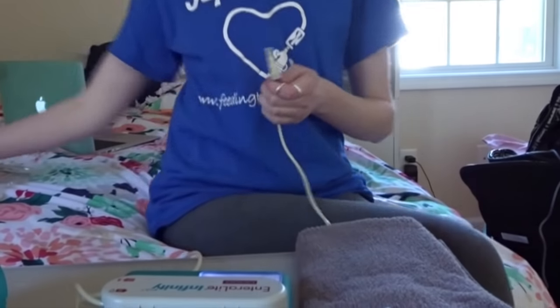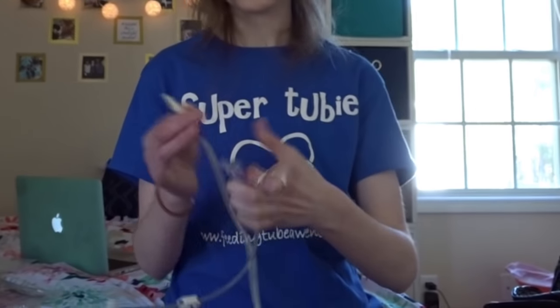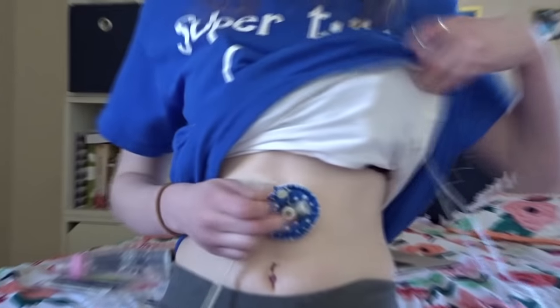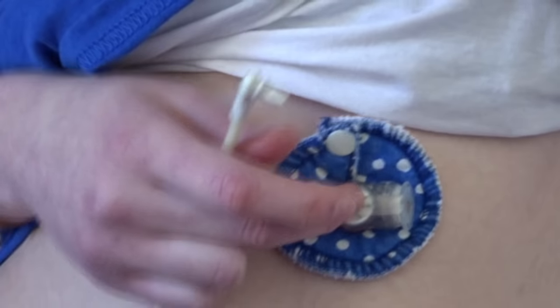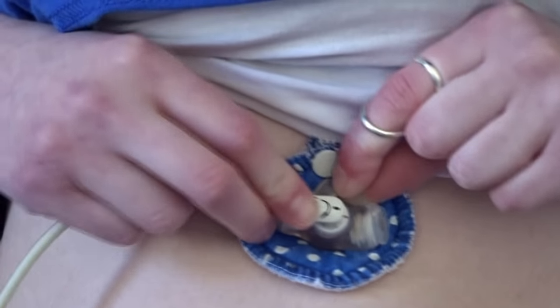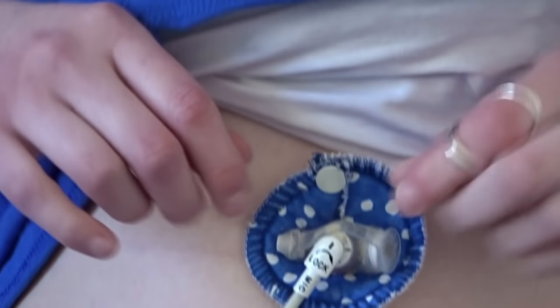Now I'm connecting the end of the bag to the extension. The last step is to connect your extension to your tube and click run. The kind of tube I have is a GJ, which gives access to both the stomach and the small intestine for feeding. The port on the side leads to the stomach, and the port in the front leads to the small intestine, which is called the J. You match the lines, and then twist the extension to lock it into place.